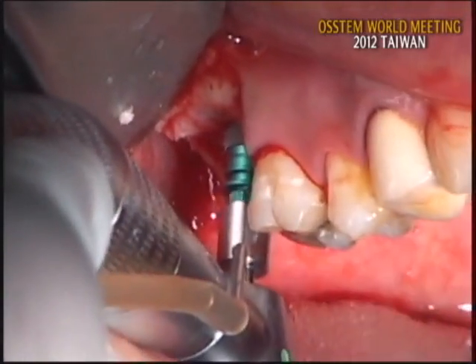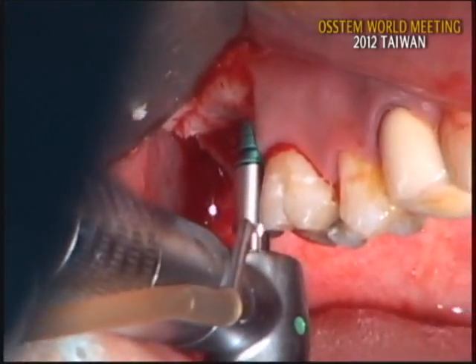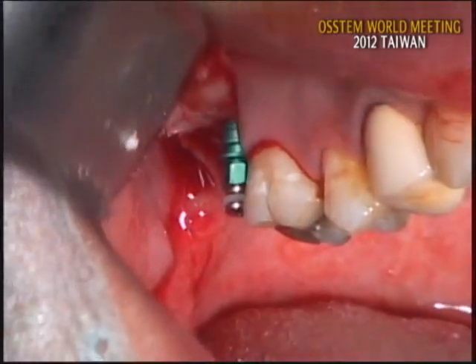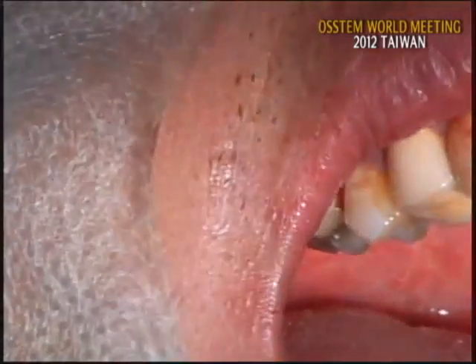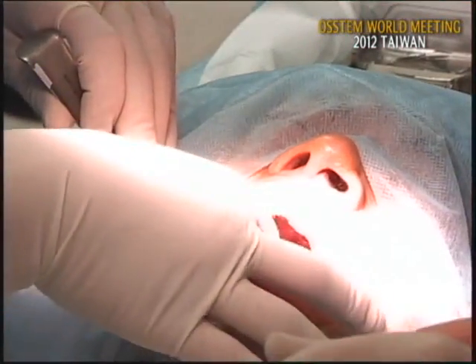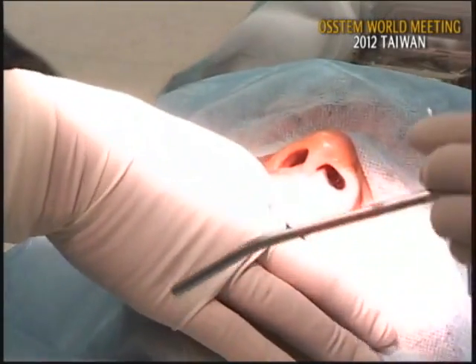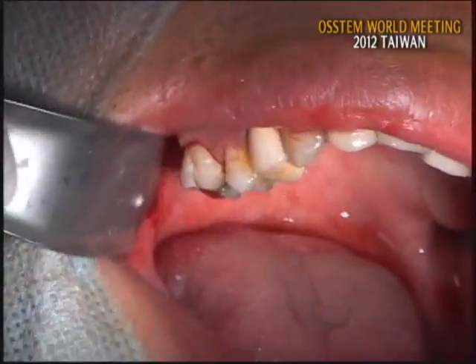Okay, torque is weak. I think the bone density of this patient is relatively weak, so the final torque is not so high. Anyway, I will submerge this fixture because the opposing tooth is elongated, so the occlusal clearance is not so good, so it's better to submerge it.